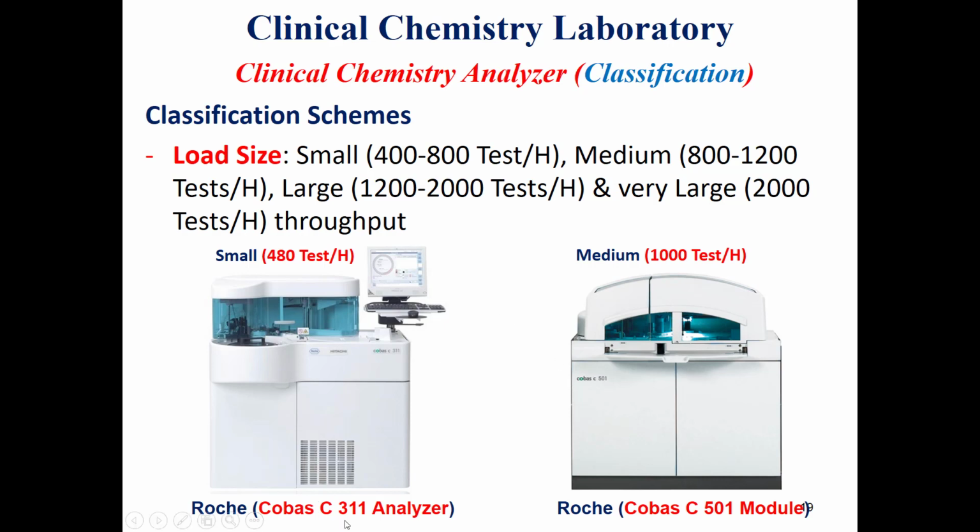The Cobas C311 will have a maximum load size of 480 tests per hour, which is considered a small load size, whereas the Cobas C501 will have a maximum load size of 1000 tests per hour, which is considered a medium load size.